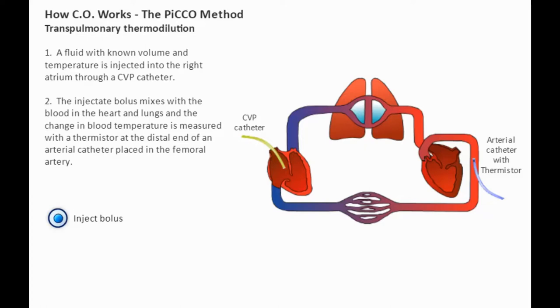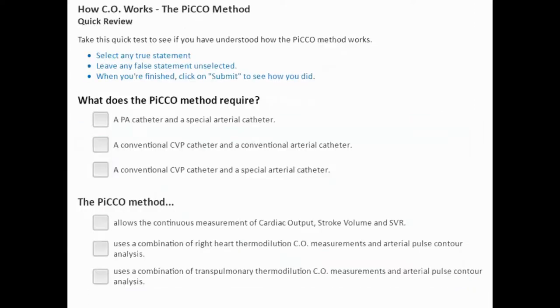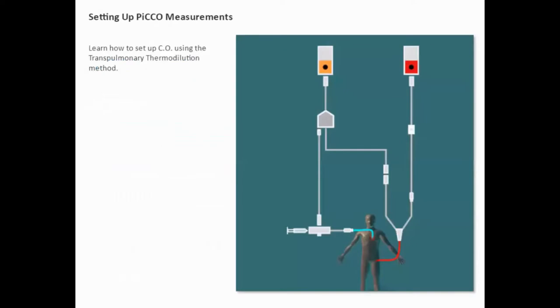So like in the setup, you can see how it is detected. Then the picture that is shown on the screen, a cardiac output curve like this, is seen on the screen. And then the arterial ABP waveform is displayed like this. So this explains a little bit about the process. So I will anyway do that through my monitor.